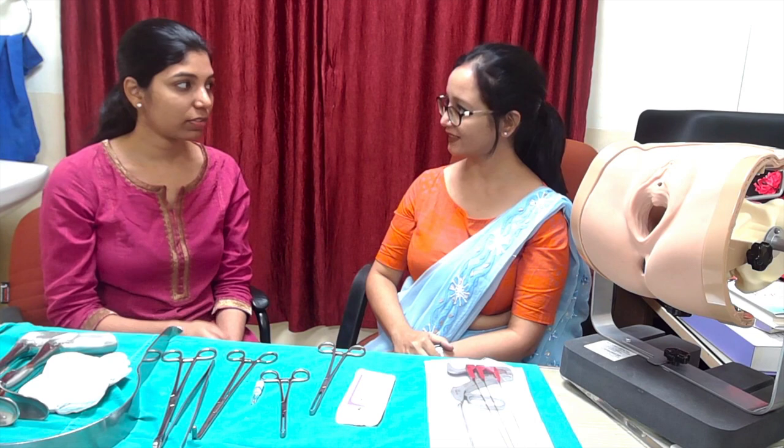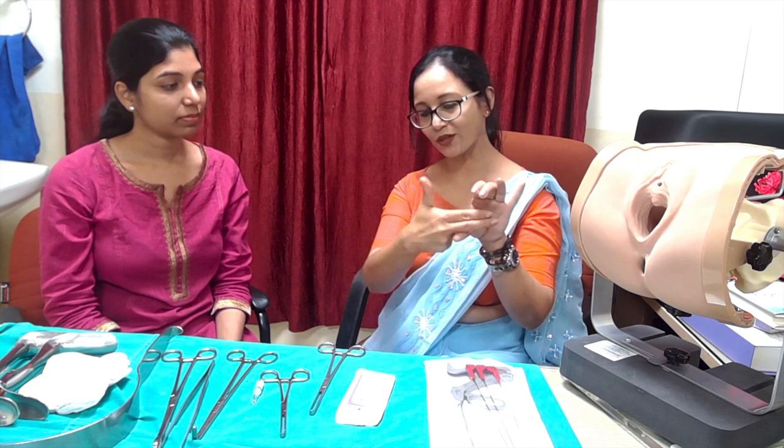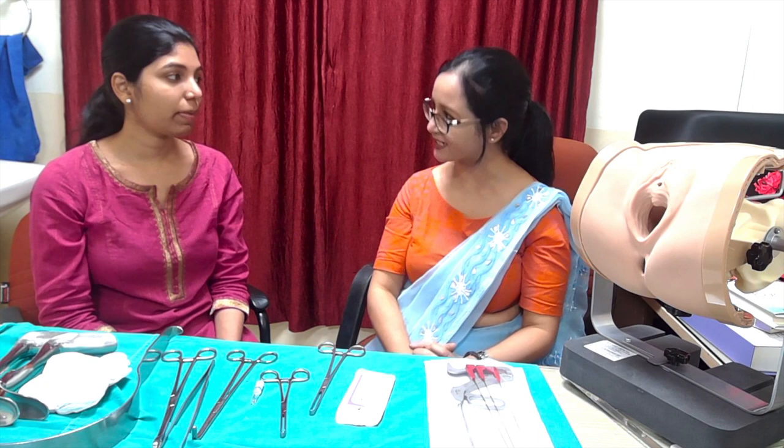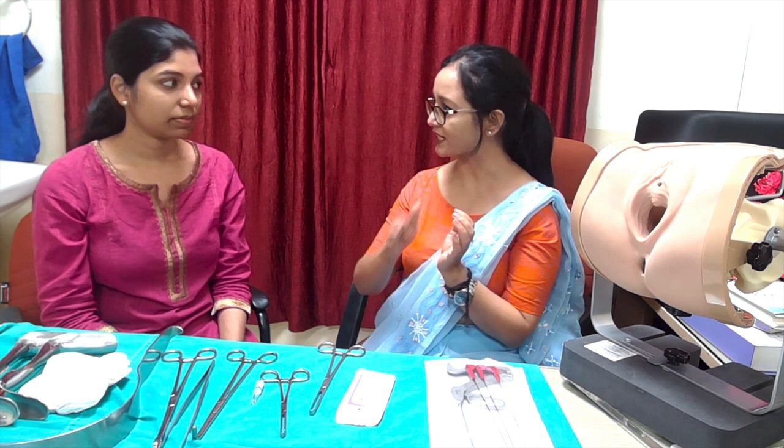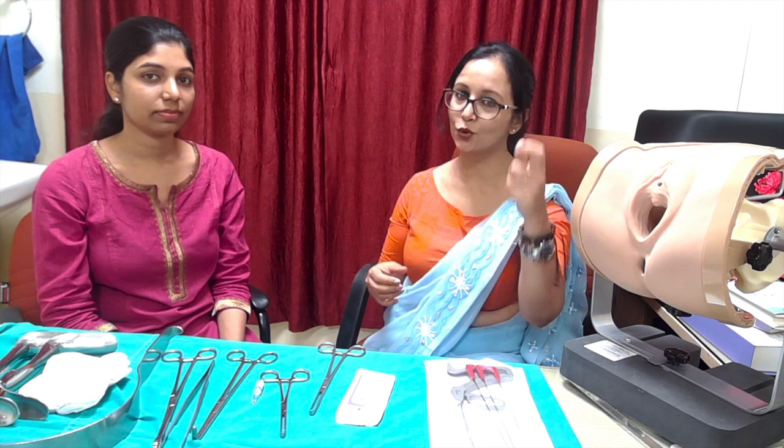To locate the ischial spine, use your index finger inside the vagina and feel for it on the lateral side. Immediately sweep your finger to access the pararectal space and then the sacrospinous ligament. The sacrospinous ligament is the upper border of the coccygeus muscle. If you cannot reach the sacrospinous ligament, you may take a bite from the coccygeus muscle — it is not entirely wrong, though the grip is better with the sacrospinous ligament.